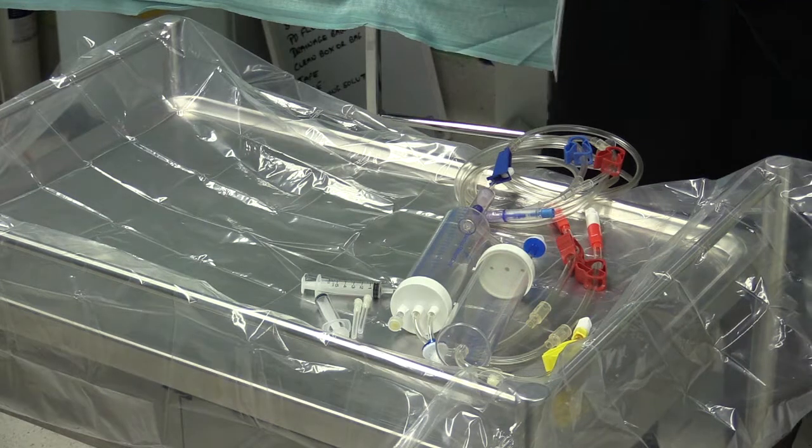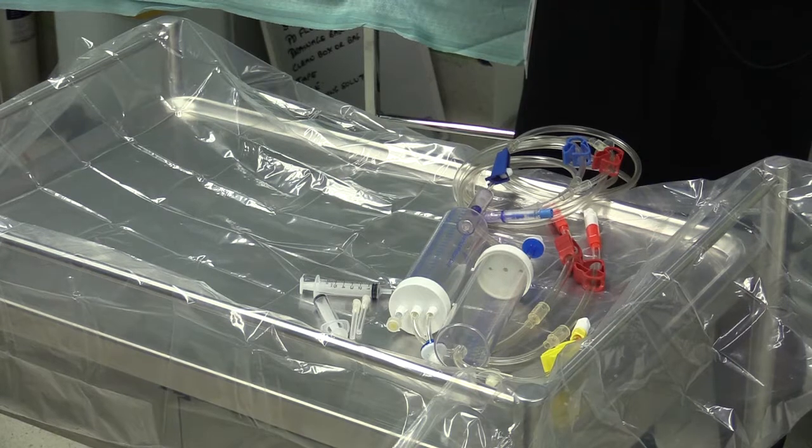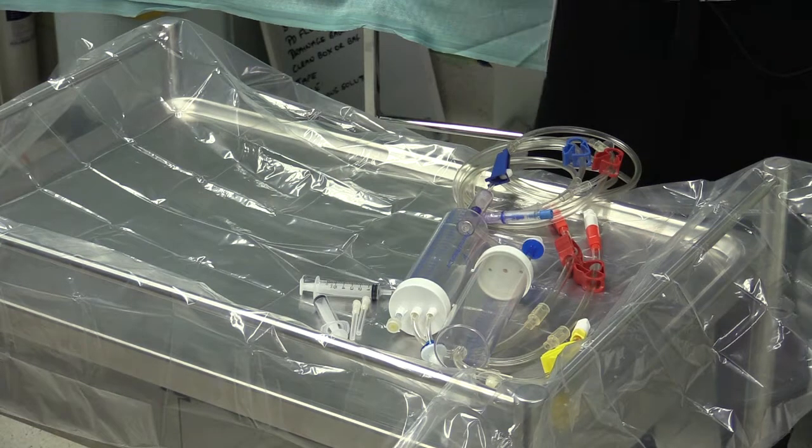I'm going to start the peritoneal dialysis using one bag of 1.5% glucose and one bag of 2.3% glucose.